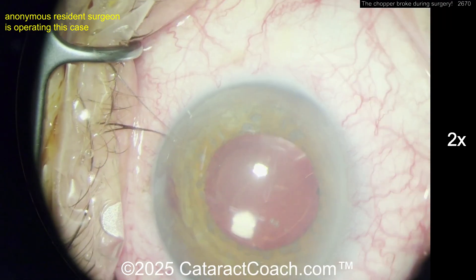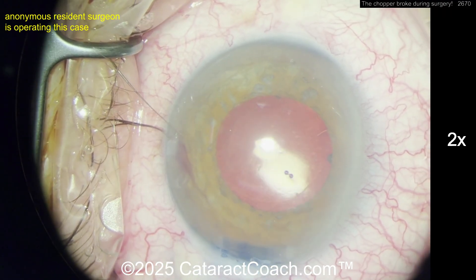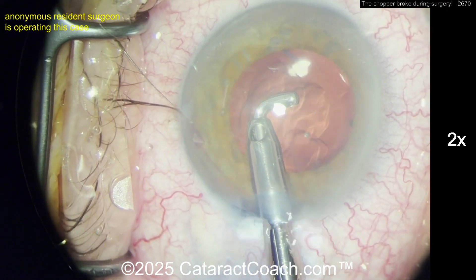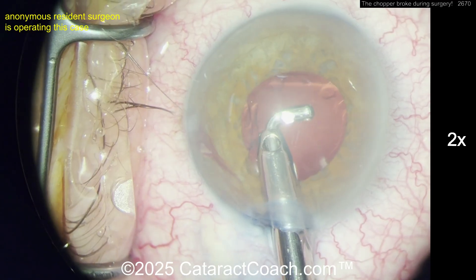Now the next step is to take out the viscoelastic and see if there's still more bleeding at the angle. Before you do that, you might want to put a gonioscopy mirror on so you can check the angle. Here's removing the viscoelastic.